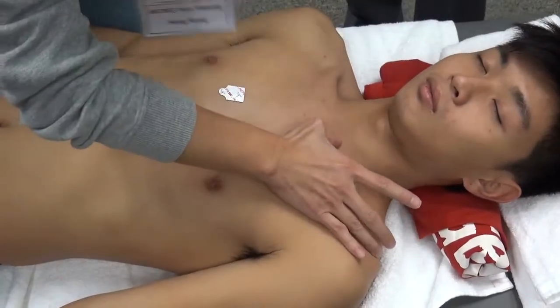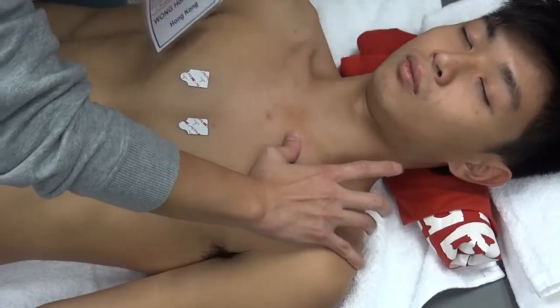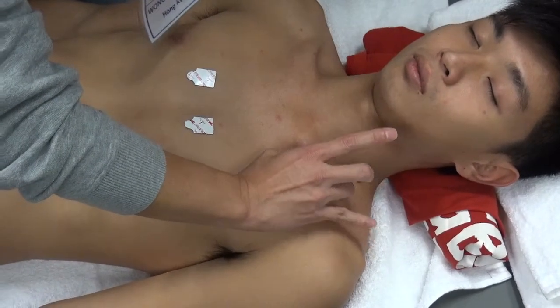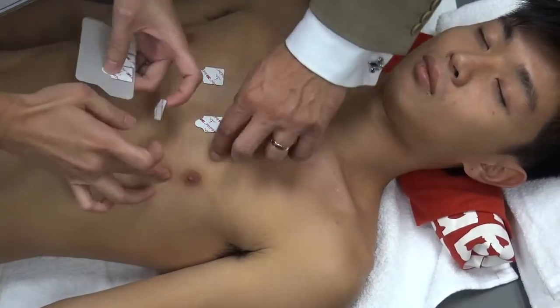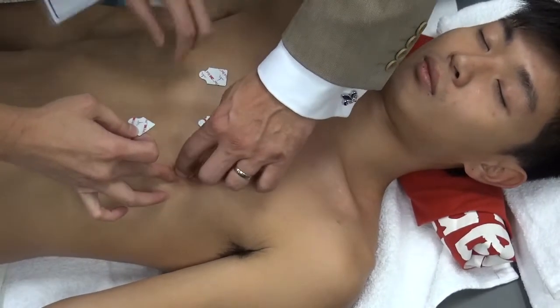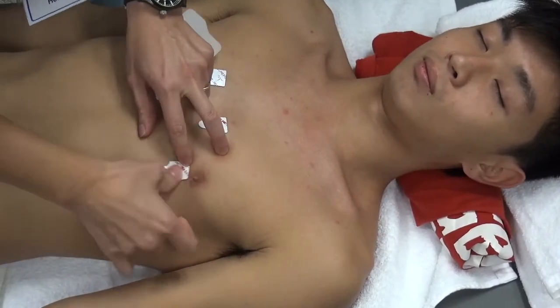So do it yourself. Okay, put your forefinger down the middle, and use your forefinger so halfway between the two. Yeah, there it is. And just follow it straight down, lovely. Okay, and it's just 1 rib space beneath. You often can't feel the rib very well, but you know it's 1 rib space beneath. And that's perfect. Okay, so that's V4.